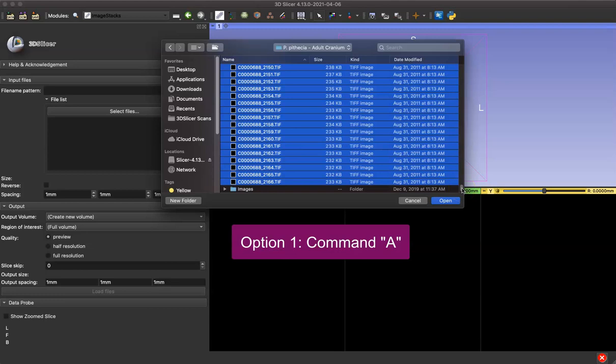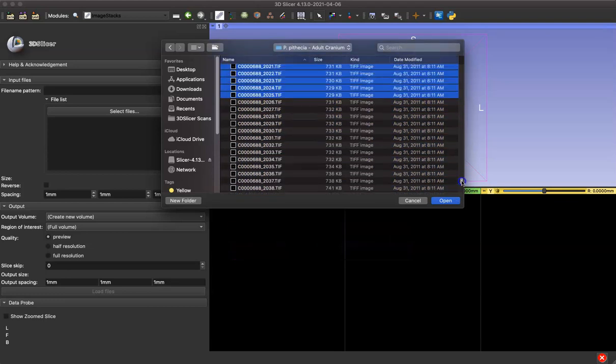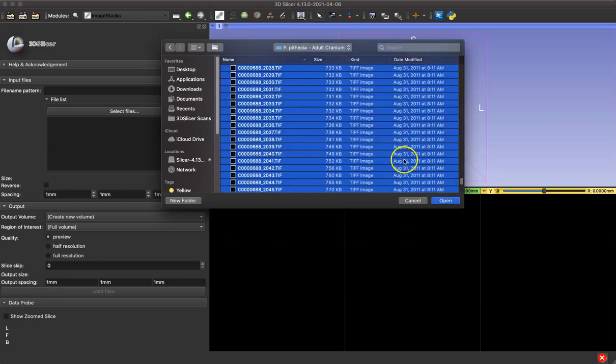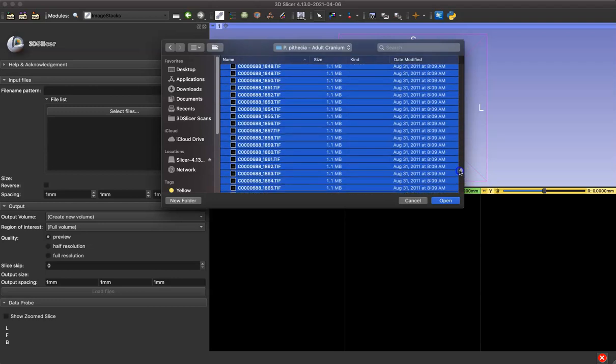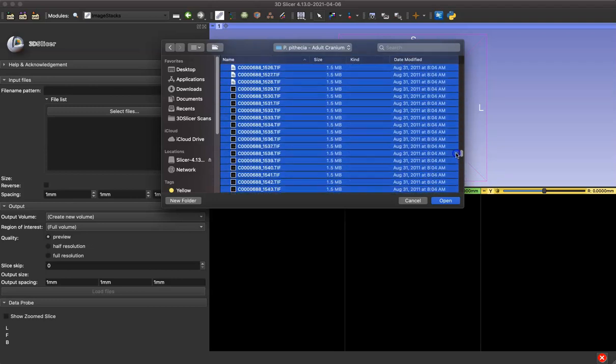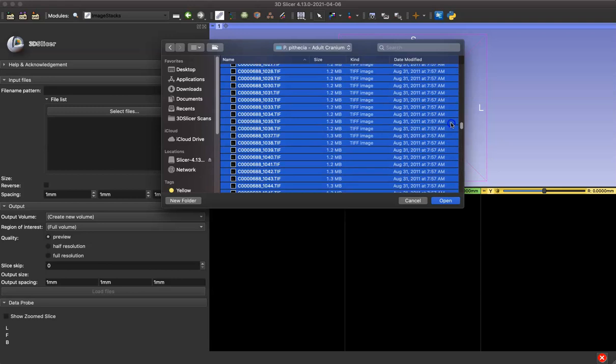One important thing to watch out for here is if your computer has missed files in that section. Every so often this happens to me and you just want to scroll up, and if you find a missing chunk, hold down the Shift button and click the lowest file and then scan through the rest to make sure you've selected everything.